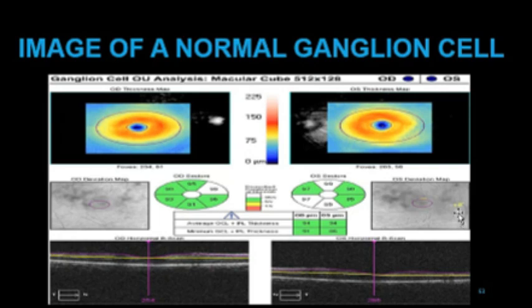Okay. I think that these two must match or should match, because you can see that there's a loss here and then OCT captured it here, yellow, showing that it is still minor. But even though it's minor, the OCT can still capture it. Okay. This is why OCT is the boss.